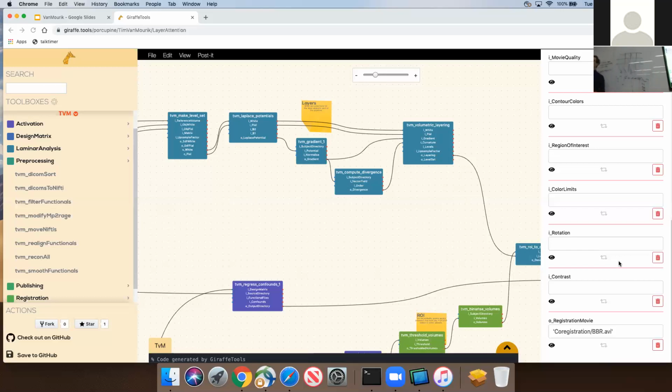Yeah, please. I guess the more voxels we use, the less. Well, is it? That's a good question. This is essentially under. No. It's overdetermined by a wide margin because you're only estimating 5. Right, but I mean, if you assume spatially different betas, then it becomes under. Right. Yeah. Sure. So you're absolutely right.